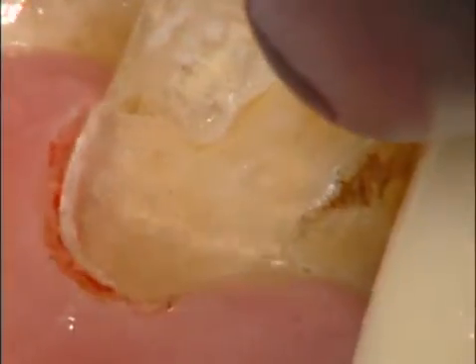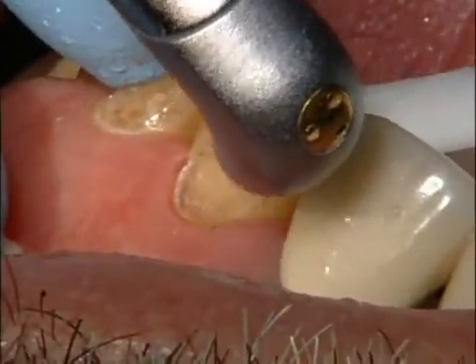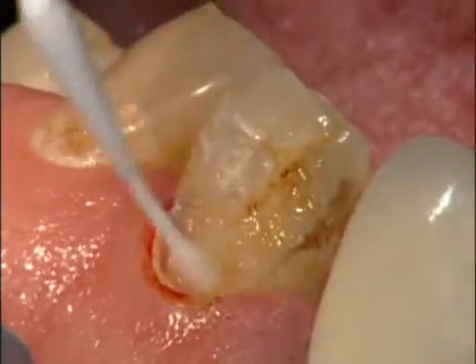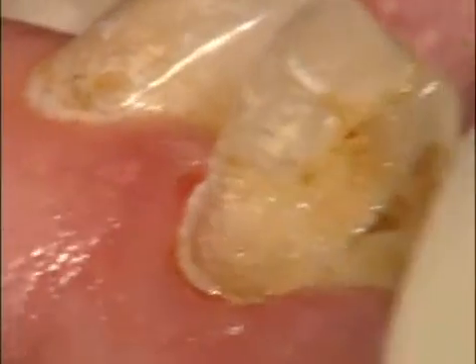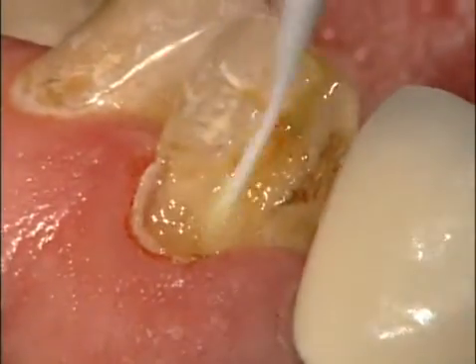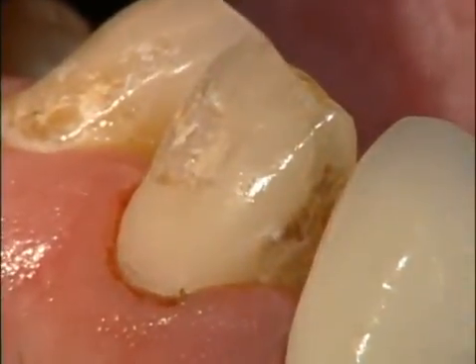In most cases, we'll get really good hemostasis with the laser in removing the soft tissue, the gingival contouring. If you have a patient where you have a little more bleeding than what's desired, then don't hesitate to use Viscostat Plus. That will ease your frustrations with the laser. We don't know every patient's condition, their blood pressure, what medications they're on, and they might tend to ooze a little bit, especially a patient like this whose oral hygiene wasn't in the best shape to start with.